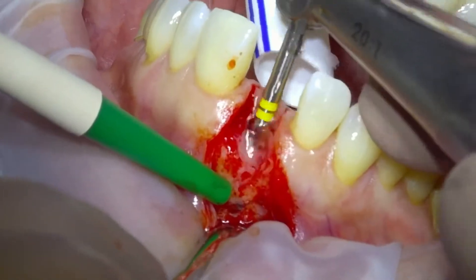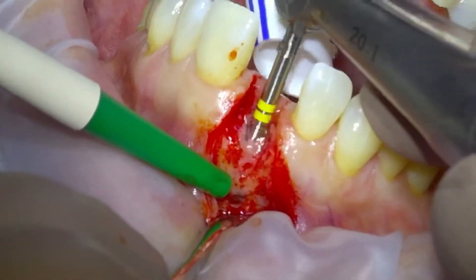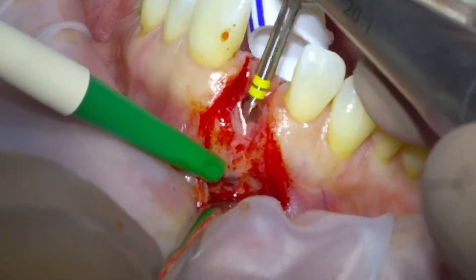We'll just profile the coronal aspect of the osteotomy. Sometimes we can collect the little bone chips. Here we have some Cerabone, and I'm just adding the autogenous bone chips to the Cerabone.